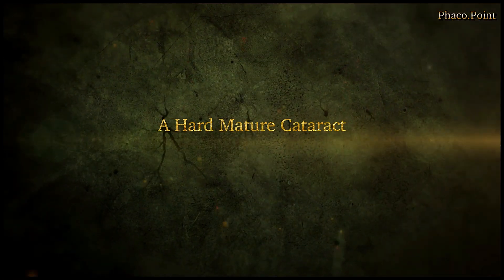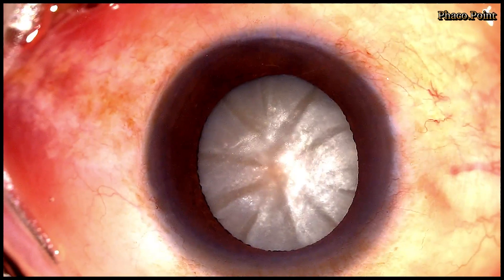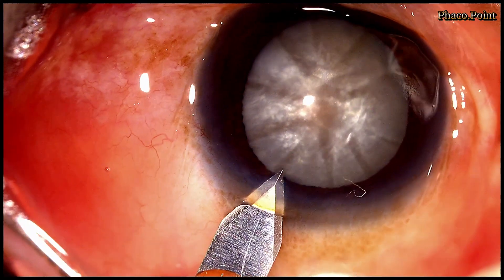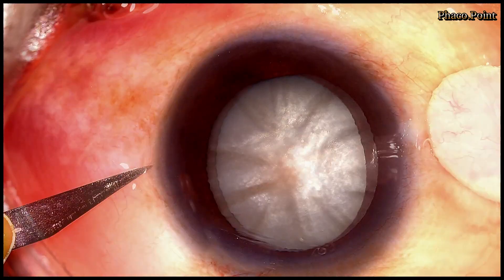This is a patient who presented to us with senile nuclear sclerosis, presenting like an intumescent, dense, mature cataract. As always, meticulous care and attention to detail is taken while making these incisions.